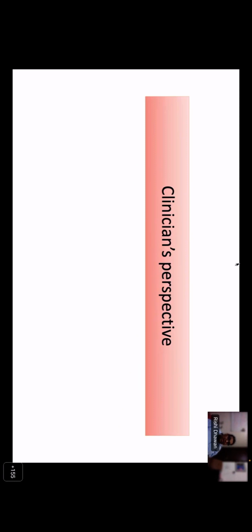Angioimmunoblastic T cell lymphoma, HLH. Aggressive NK cell leukemia. Dr. Manudesh, am I right? It is NK-LGL, the aggressive variant of NK-LGL.